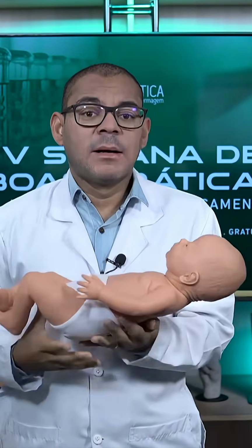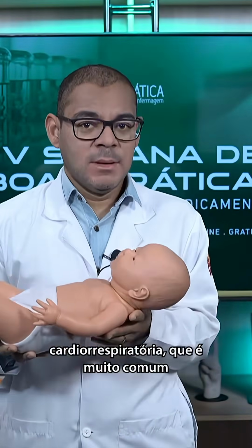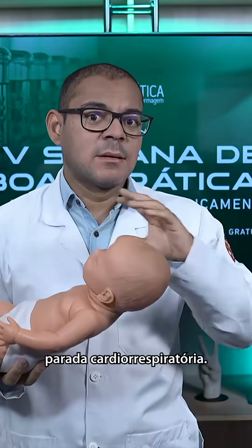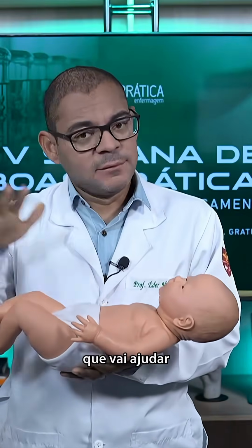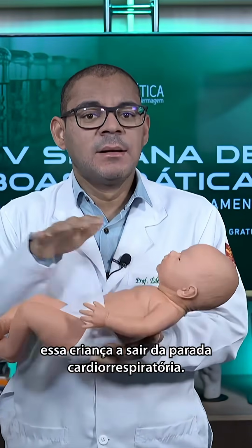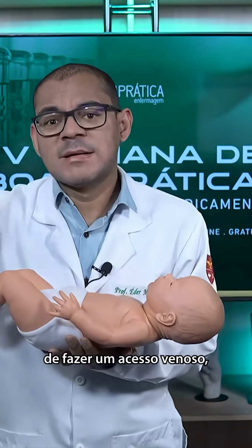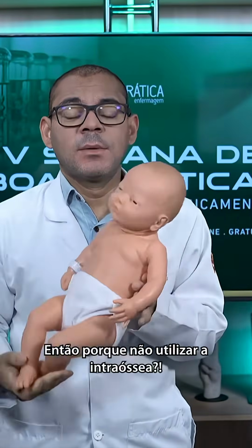Alright? So, let's go. A child arrives in cardiorespiratory arrest, since respiratory arrest is very common in children. But here I'm giving context. Cardiorespiratory arrest. I need to administer epinephrine, which will help this child come out of cardiorespiratory arrest. So I can't waste time trying to get venous access when the patient needs the medication. So why not use the intraosseous route?